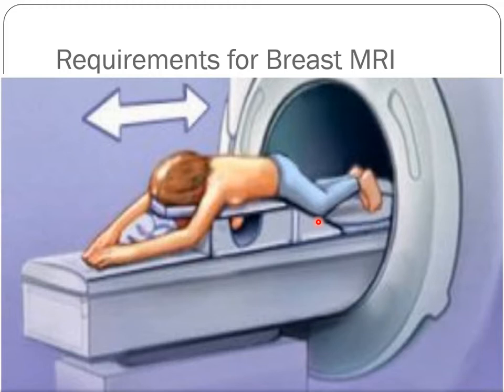So it's the opposite way. The head goes first into the machine, not the feet. I don't know why it's drawn like this, because I don't think anyone uses feet first for breast MRI. We might use feet first for knee, ankle, or foot MRI, pelvis maybe, but I don't think breast is possible.